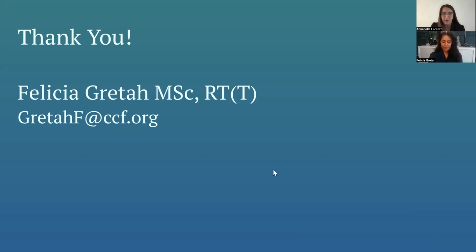We do have a question. Can you explain again the solution that allowed you to reduce treatment time from 1.5 hours to 45 minutes? Yeah, so for us, the problem with the treatment times was that the patients were still struggling to understand the process and they weren't grasping how we needed them to breathe. So we added a little bit of extra time to the simulation day so that we could spend more time upfront training and ensuring that they were really well prepared to go into the treatments. That in itself was a huge help. And then also watching the video to just get them better acquainted. Really, the upfront training is what improved ultimately the treatment times in the end.